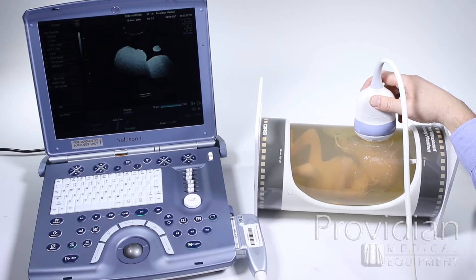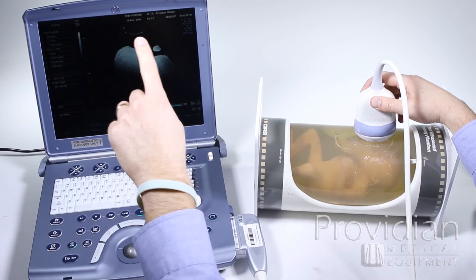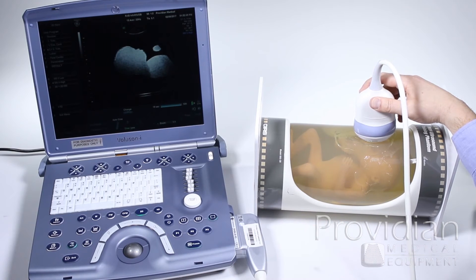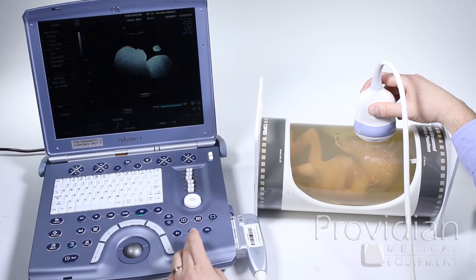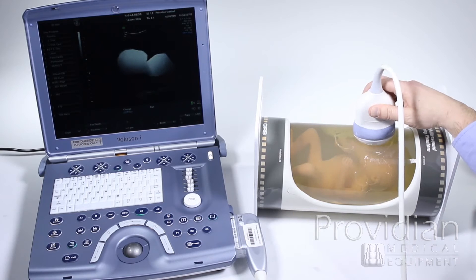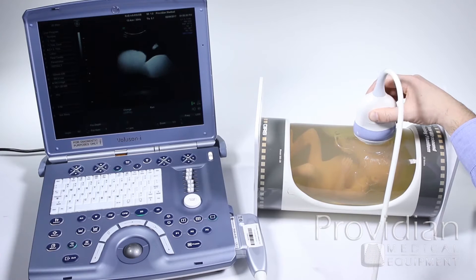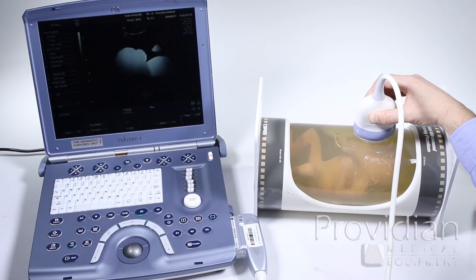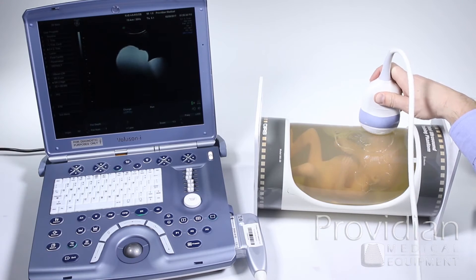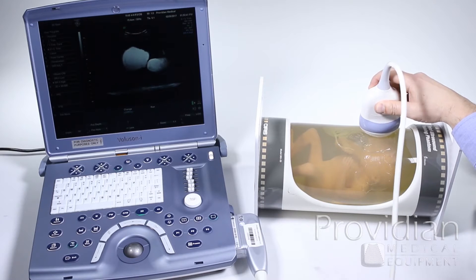The ideal 4D image is where you have fluid right in front of the face. If you can get a good pocket of fluid in front of the face, you're golden. Just remember that you are looking at one thin slice of the baby's face — this may be perfect, but if you move the probe over a little bit, you might find there's a hand on the other side. So when you go to 4D and see fingers, sweep the probe back and forth. This is like that loaf of bread where I'm sweeping and looking at different slices, showing if there's anything on the surface of the baby's face that might be blocking the image.